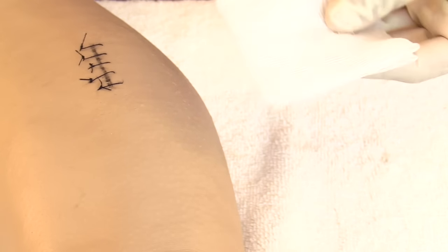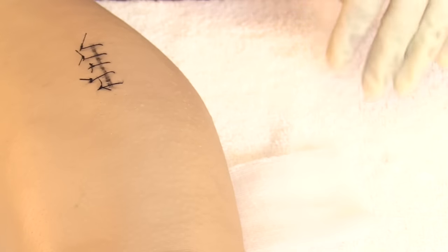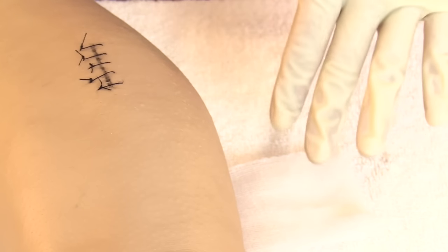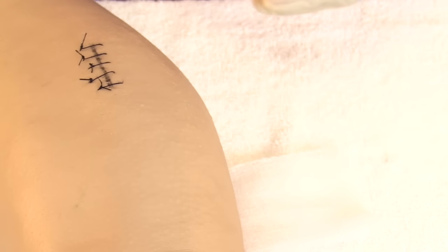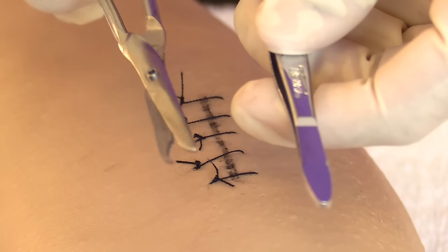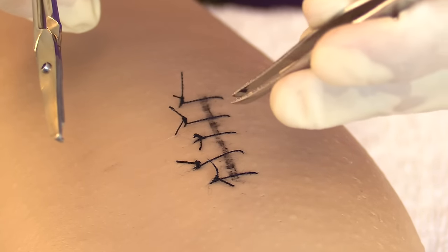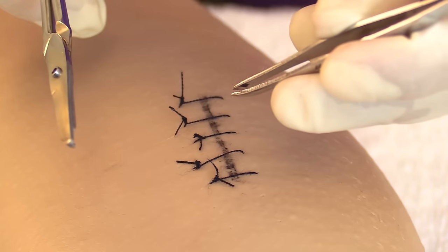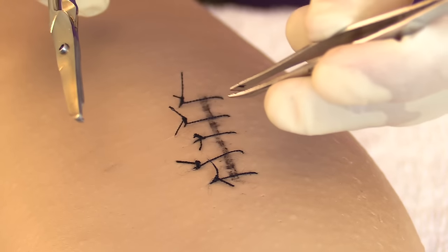Once the area is dry, take your gauze and set it beside your work area — this is where you'll drop each removed suture. Dispose of them properly according to hospital protocol, as they are a biohazard. Count how many sutures you remove, analyze each to make sure the thread is intact, and document. Hold tweezers in your non-dominant hand and scissors in your dominant hand. Remove every other suture starting at the second one to prevent the wound from opening prematurely.